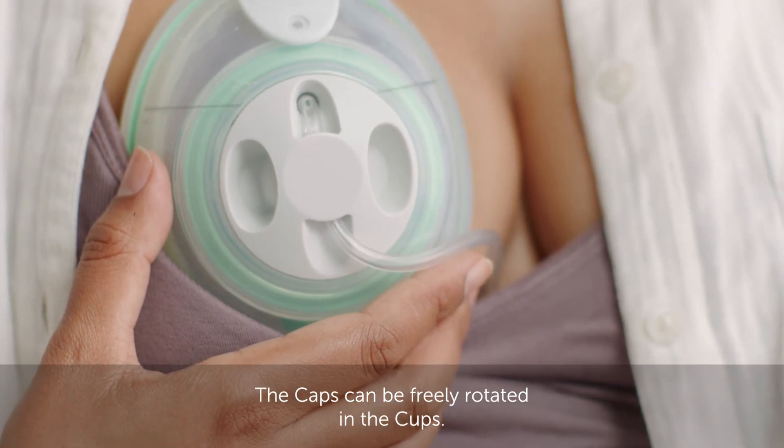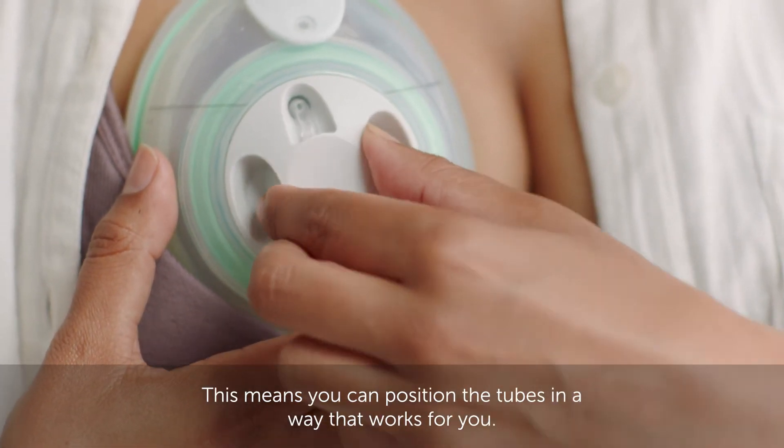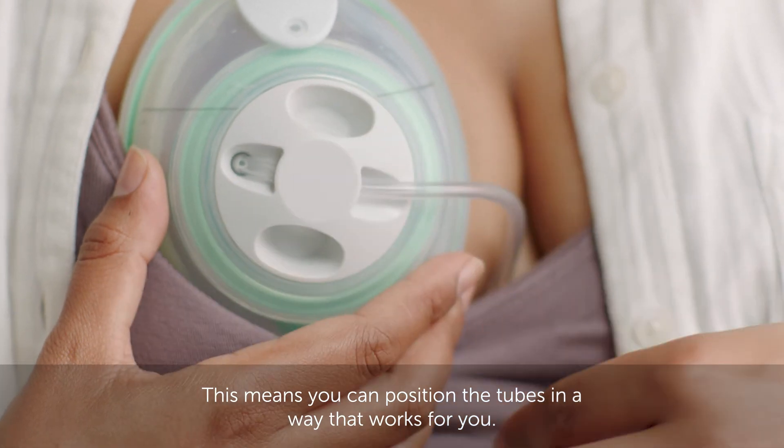The caps can be freely rotated in the cups. This means you can position the tubes in a way that works for you.